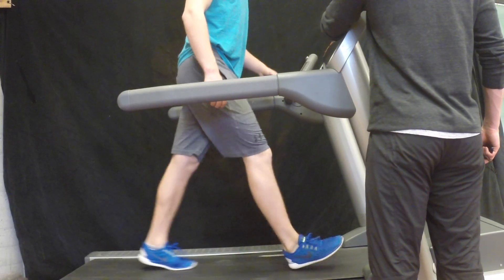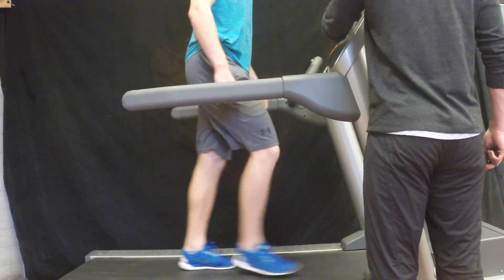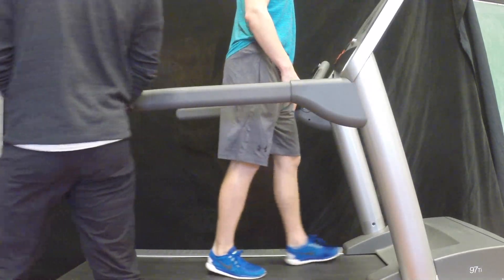If steady state heart rate was achieved — that is, less than 5 beats per minute variance — then the test is complete. If the final heart rate varies by more than 5 beats per minute, then extend the test minute by minute until steady state is achieved.